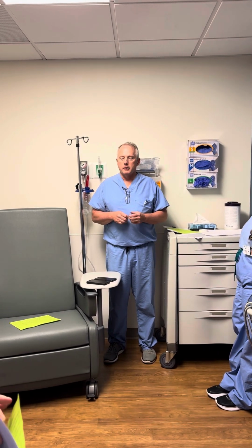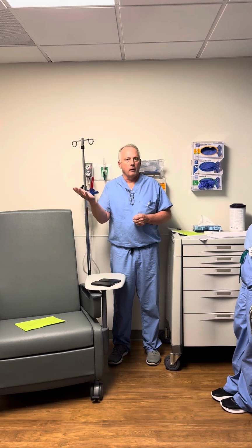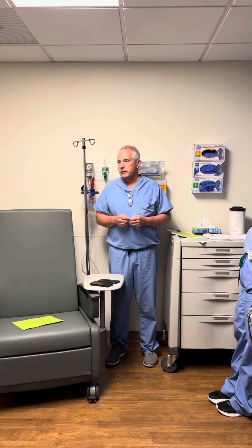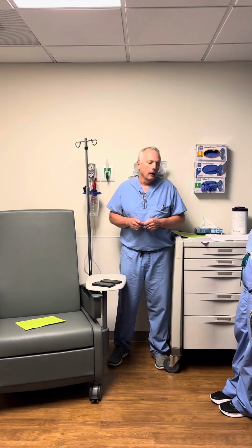As far as device reaction, a magnet on a pacemaker will make it blind to any EMI, essentially from cautery, which is what you experience here more than anything. So it'll disable that ability. It'll make it blind, and then when you pull it off, it'll go right back to its regular mode. It's very rare that we see a reed switch, which is what is activated inside the device, stick and just stay in a magnet mode. A lot of times that won't even be caught until the patient starts to complain 2 days later that, gosh, they don't feel right. But in 25 years, I've seen that maybe one time.